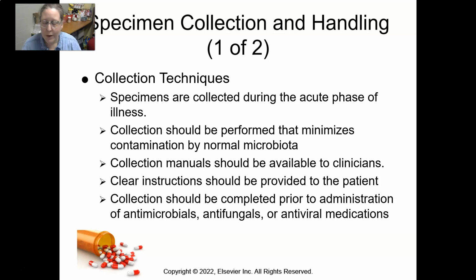All right. With microbiology, like any other aspect in the lab, it all starts with a good specimen. So you need good specimen collection and handling. The specimens are often collected by our nursing staff or maybe our respiratory staff, and so sometimes the lab may have to do some in-service training if there are problems with collection techniques. Typically, specimens are collected during the acute phase of illness, so when they present, when they're sick, when they're having signs and symptoms. The collection should be performed so that it minimizes the contamination by normal microbiota.